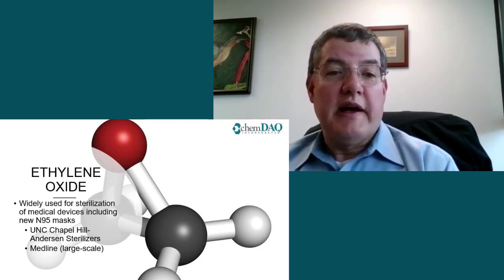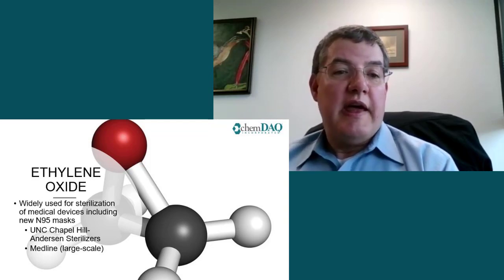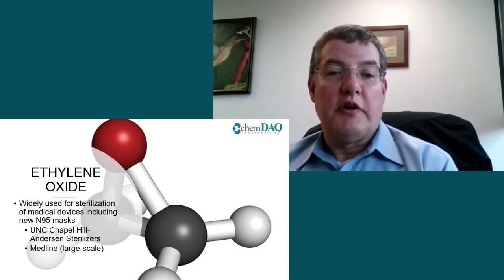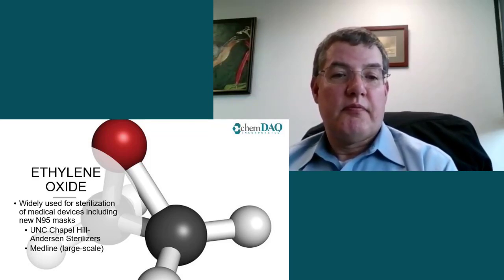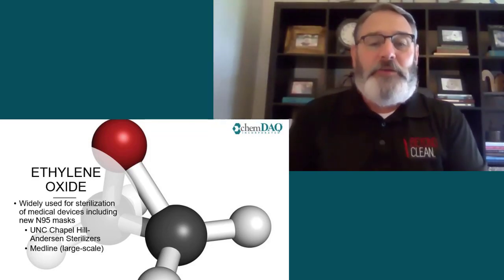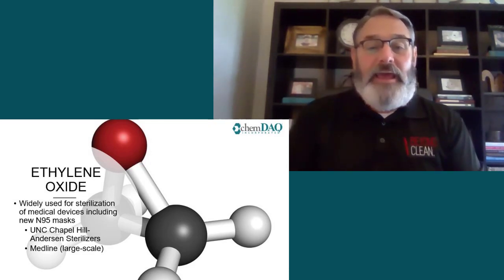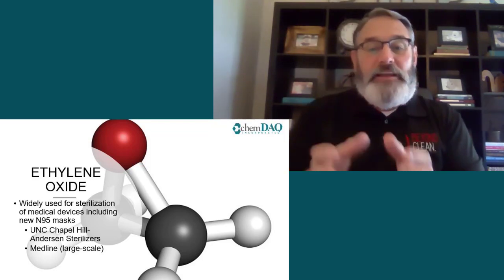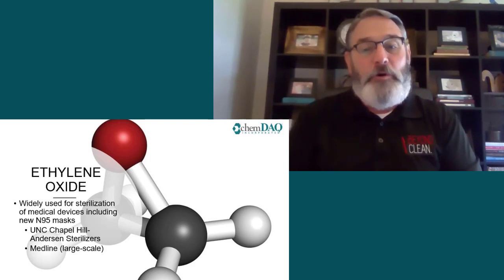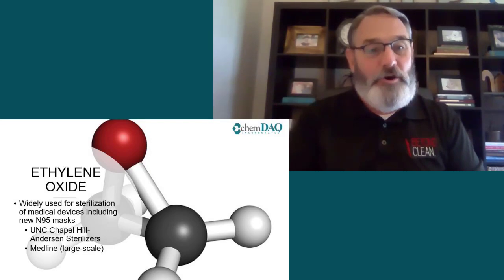On a large scale, Medline Industries is also reprocessing 100,000 N95 respirators and other face masks per day in its sterilization facility in Redmond, Oregon, and is looking to ramp up to 250,000 masks a day. That's very interesting, Richard. Ethylene oxide is known to be highly effective at killing spores. And it's also interesting to me that there's been a push in some facilities to eliminate it, even though the permissible exposure limits are the same for both ETO and hydrogen peroxide, according to OSHA.